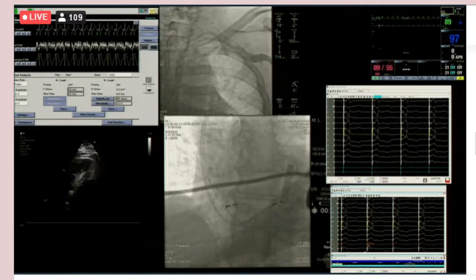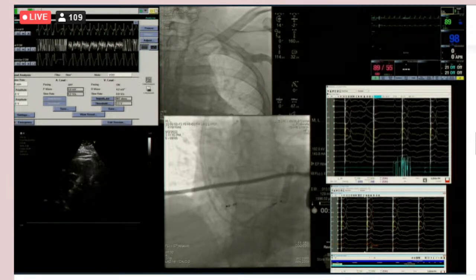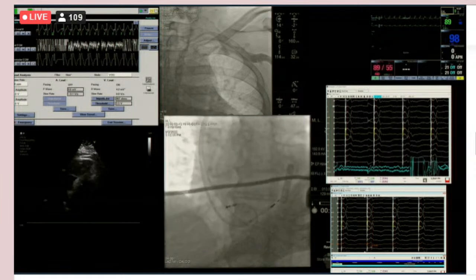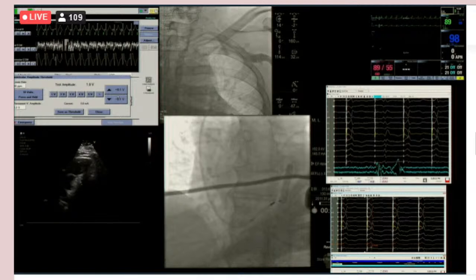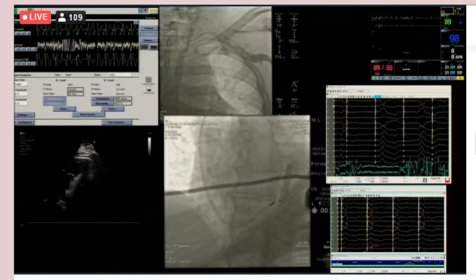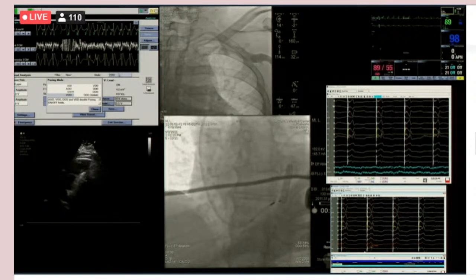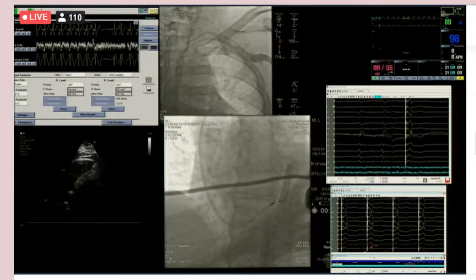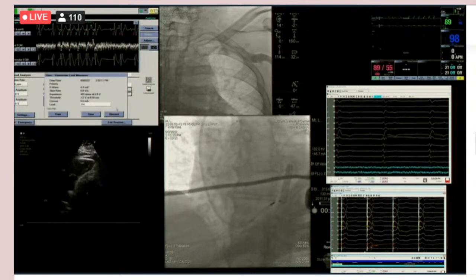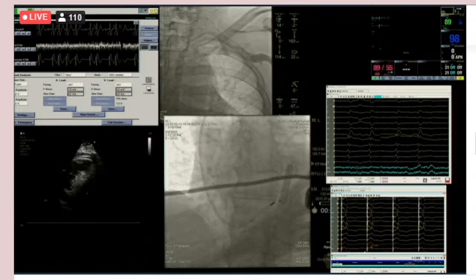Okay, so I need the atrial lead. So I think the KISS cap served its purpose. I just wanted to demonstrate what that was. I don't normally do that. I just wanted to show where this is. This is generally a couple of centimeters directly across. It's not even toward the apex. It's almost like a horizontal line directly toward the sternum compared to the HIS lead.